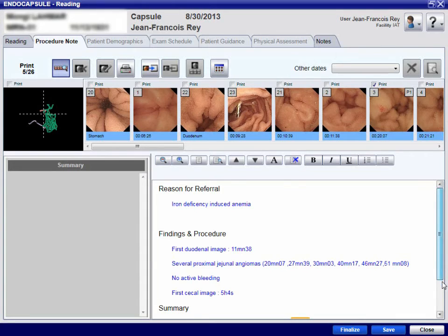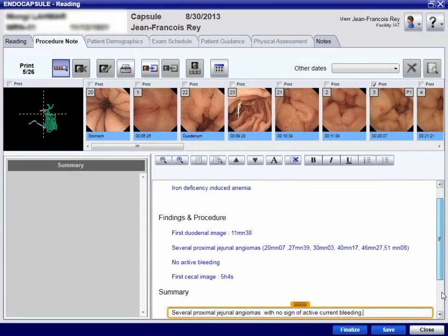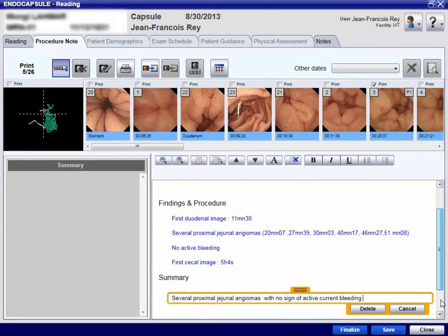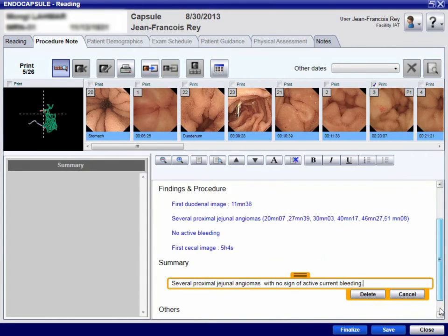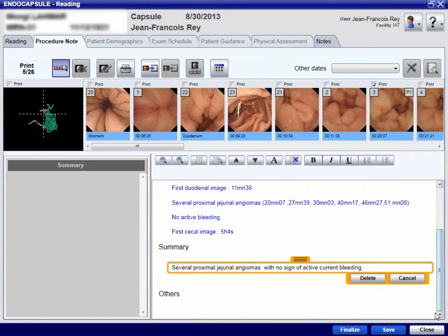When the report, including the video capsule images, has been finalised, it can be saved and printed.